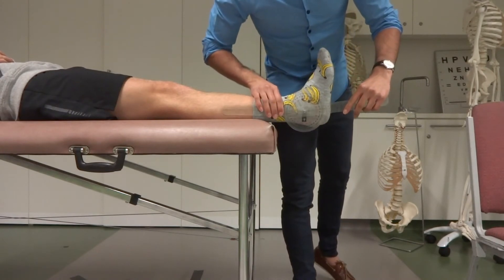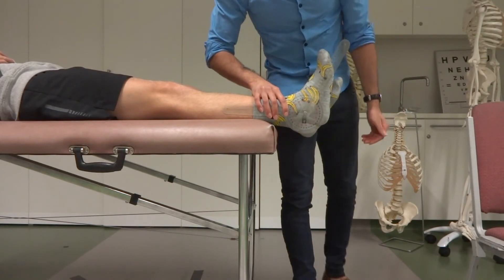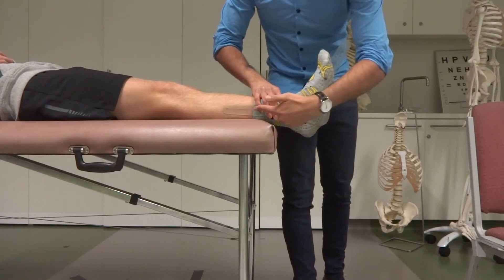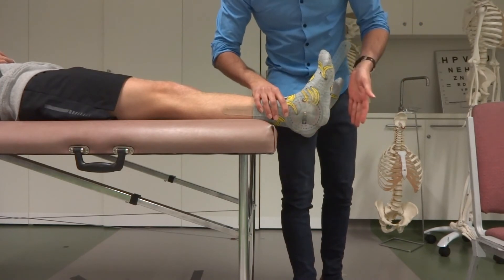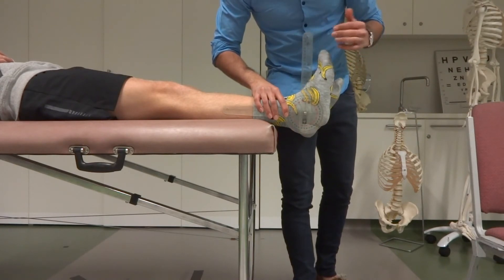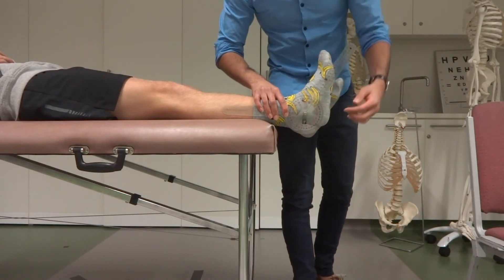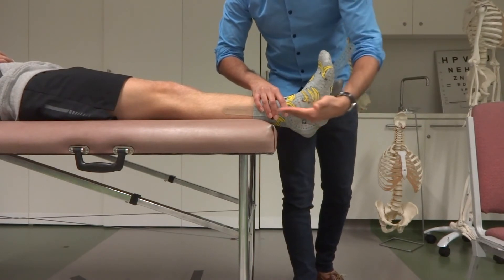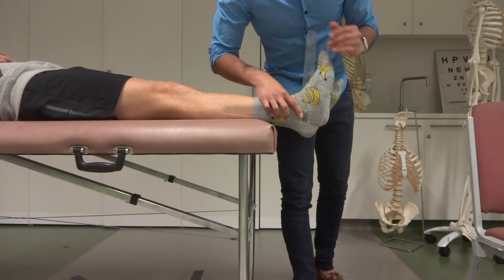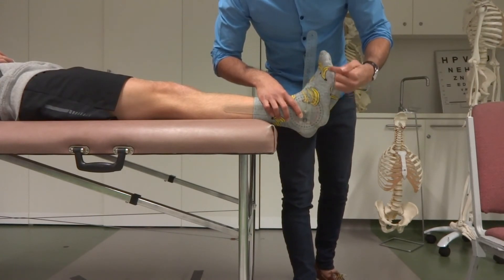If I line up my landmarks and put this movable arm on his foot — what we normally do is put the movable arm on the segment — you can see the goniometer isn't really telling me what his ankle is actually doing. That's because the axis of rotation is more proximal than usual. So I actually need to make sure that my movable arm is parallel, running in the same direction as his fifth metatarsal.